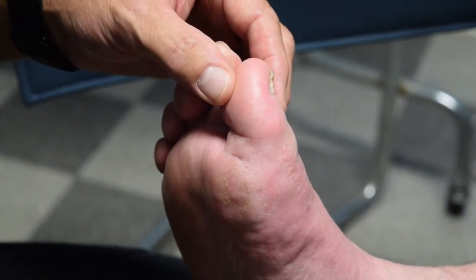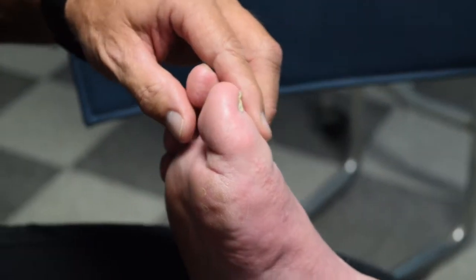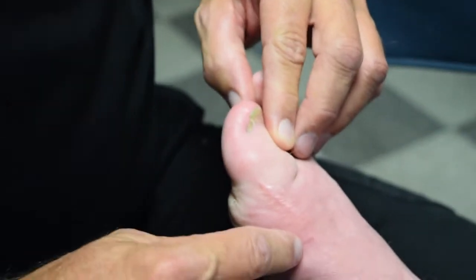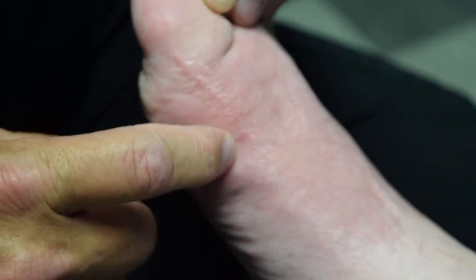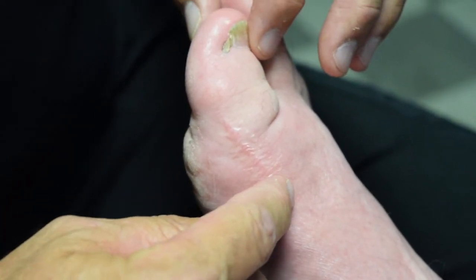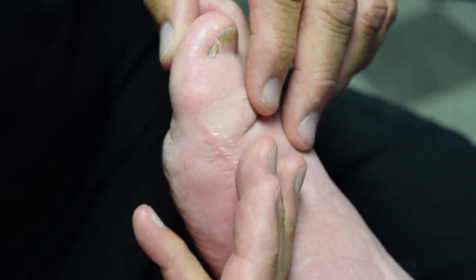To correct this and keep it very non-complicated, we made a small percutaneous incision right here. We did this under fluoroscopy and made an angled cut in the bone to lift this bone up.